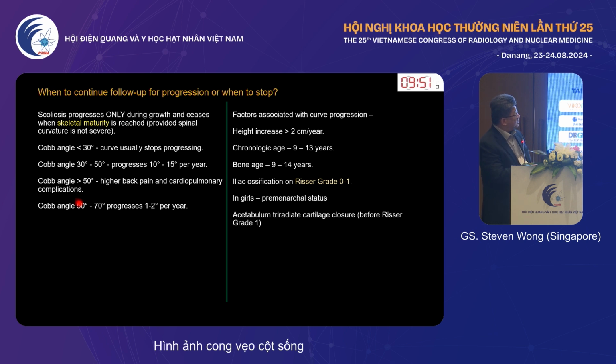You look at the Cobb angle and see whether there's progression of Cobb angle year on year, all right? Cobb angle is affected by a lot of stuff. Height increase for the patient as normal. You know, kids grow up, and if not corrected, their scoliosis may get worse.